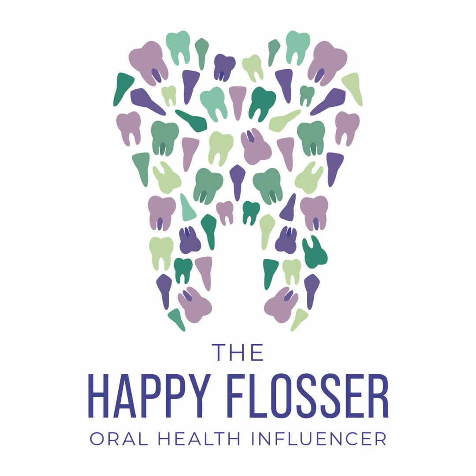Is it mobile? What does the bone look like? What's the effect on the cortical bone when you look at the radiographs? Is it expanded? Is there displacement? Is it thin? Is it thick? Has there been destruction? So when you start looking at radiographs broadly and you see something, you're looking at the margins, you're looking at the lesions. Is it radiolucent? Is it radiopaque? Where is it located? Does this patient have any symptoms or are they aware that it's there?